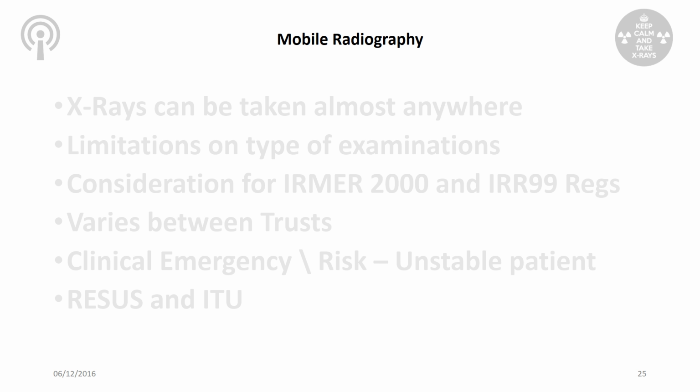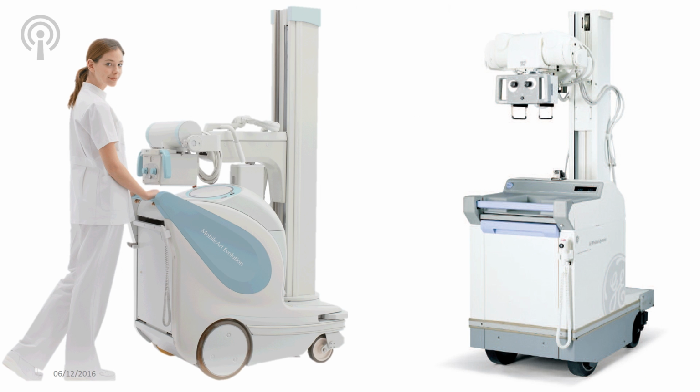So let's go through what it looks like. You may have seen these if you've been around a hospital. On the left-hand image is the Mobile Art Evolution from Shimadzu. It has to be said with an anime character voice: Shimadzu! It sounds like an anime character. And this is the GE tank. I call it the tank.